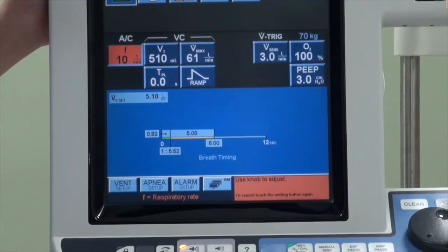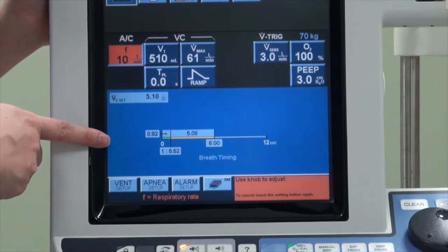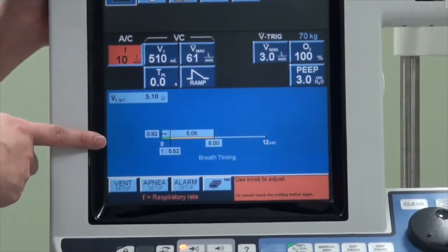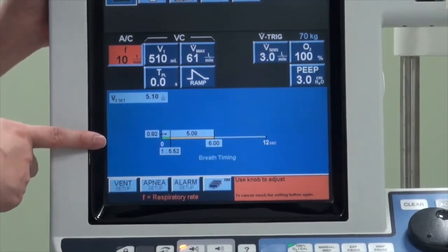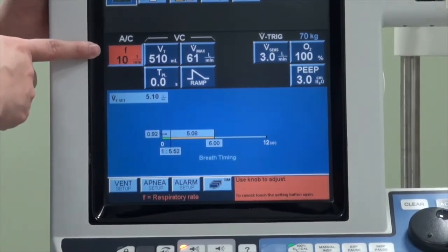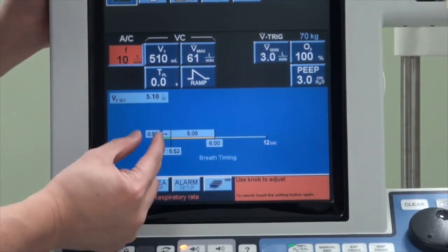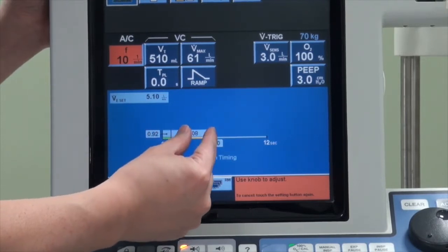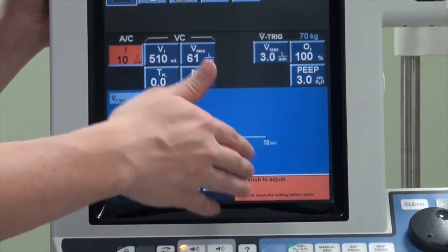You will also notice a second screen that will change depending on the settings above. This gives a representation of the inspiratory and expiratory time. When you set a frequency of 10, your respiratory cycle will be about six seconds, and the machine will tell you how much time is spent on inspiration versus expiration, giving you the inspiration-to-expiration (I:E) ratio.